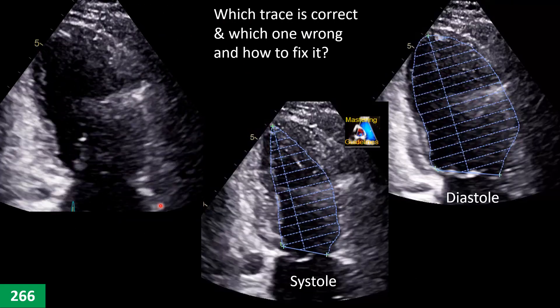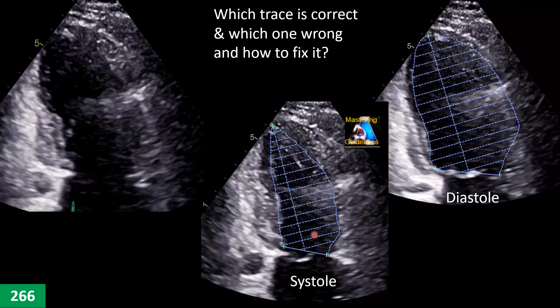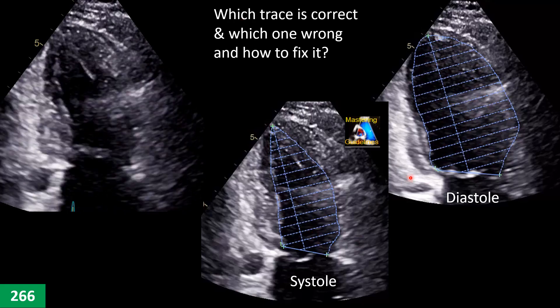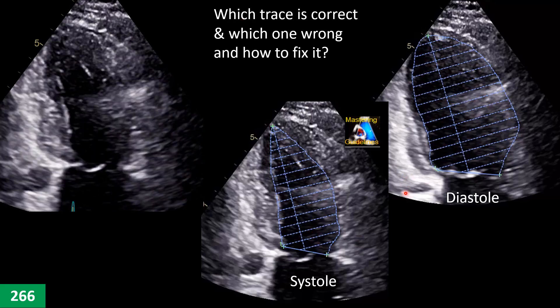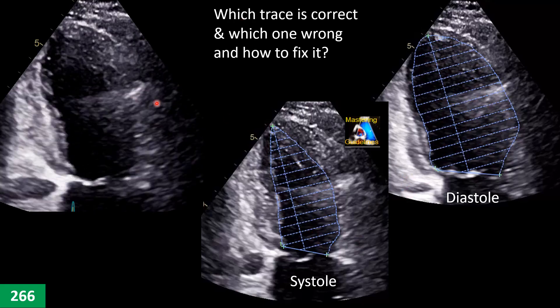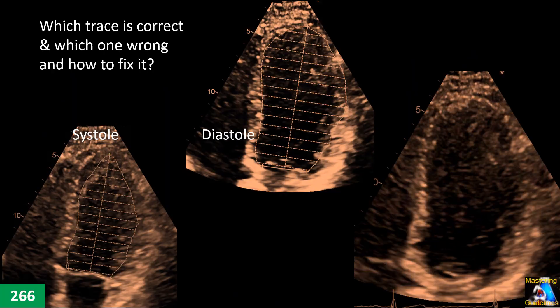Here is another two-chamber view — diastole and systole. Which one is correct, which one is wrong, and what is the correct one? How can we fix it?